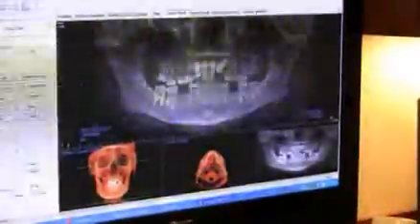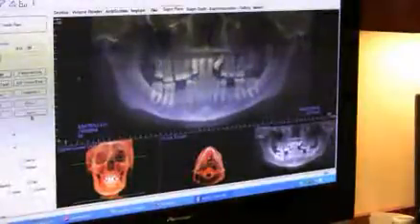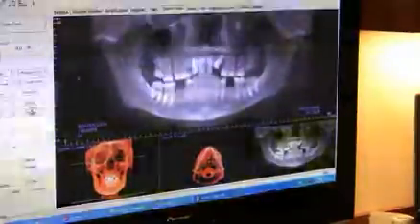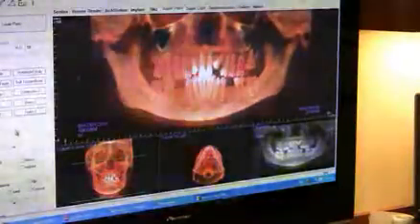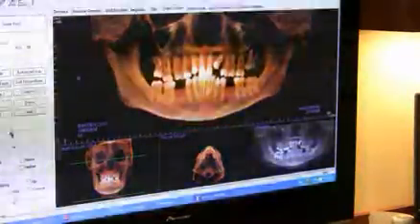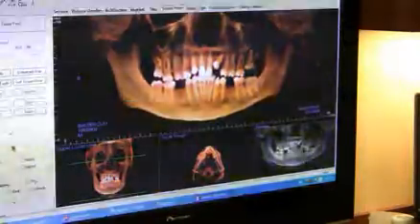And with this technology, we can then add some false color to this if we want to more closely study something, and it just helps us to be able to pick up areas of pathology or something that doesn't seem to be quite right. We just have the capability of altering a digital image.